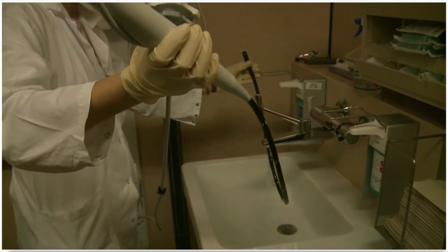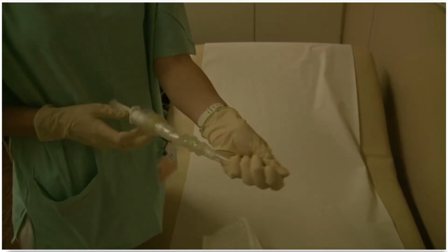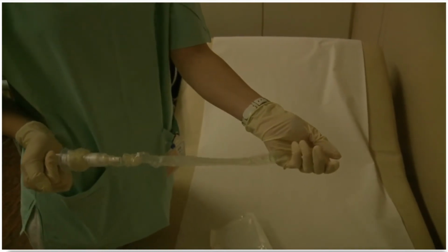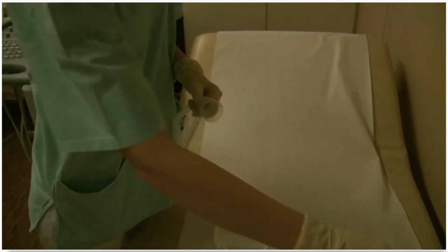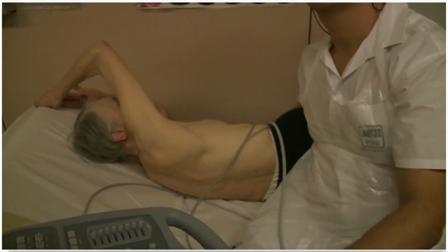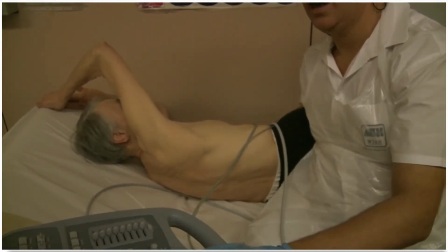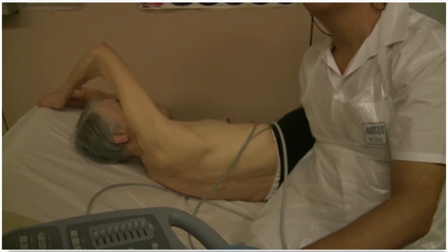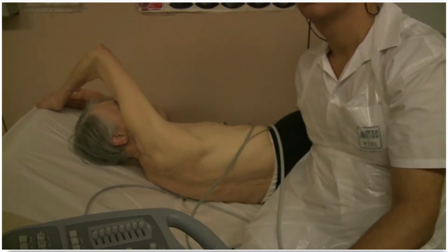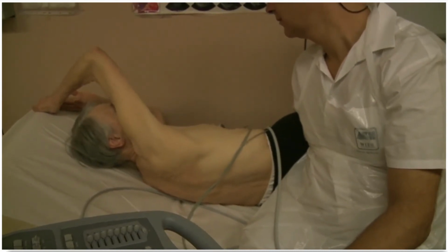Here you see how we rinse the probe, and that we fill the condom with a gel, which makes it easier to put the probe inside the condom. Before we perform a TE, we always perform a transthoracic echo. This speeds up the procedure because we know what we're looking for and we can focus on the things that we want to see only from a transesophageal approach.